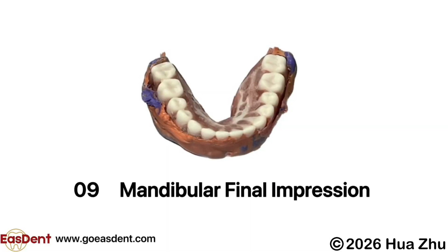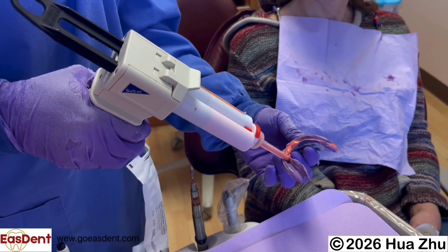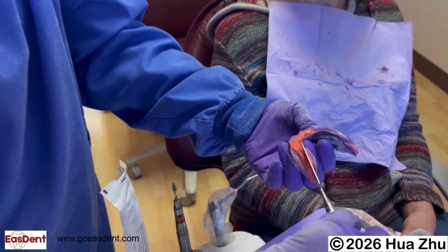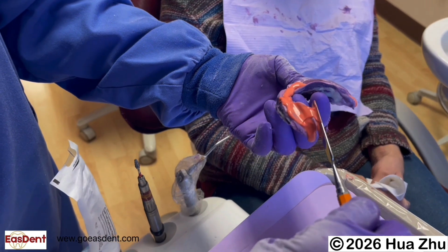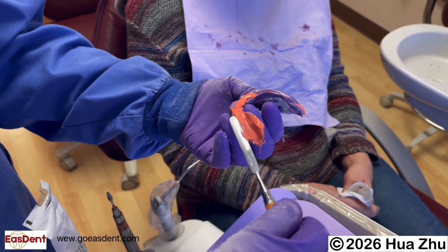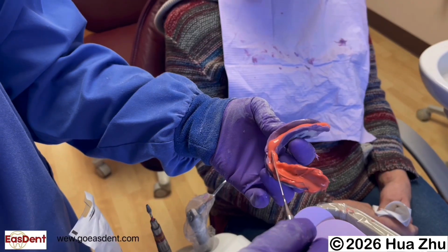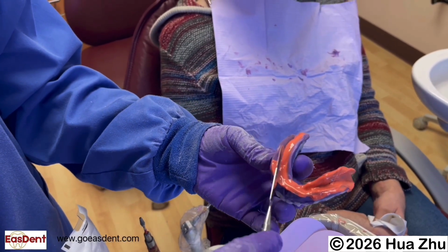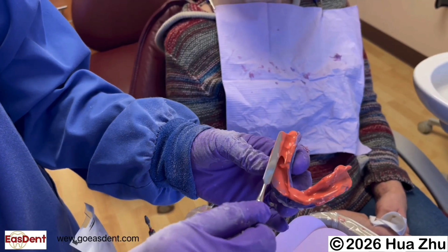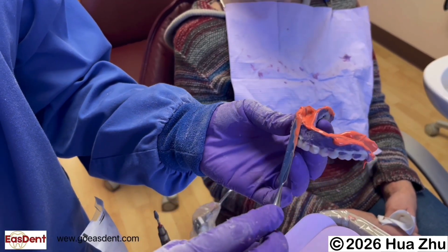Mandibular final impression. Put a thin layer of regular set light body PVS impression material on the tissue side of the tray. Use a mixing spatula to apply the material to cover the tray evenly. Make sure the border is also covered. Do not put too much material. It may be difficult to seat the tray back to the correct position, which can cause Easdent teeth to be moved to a wrong position. The VDO may also be increased.